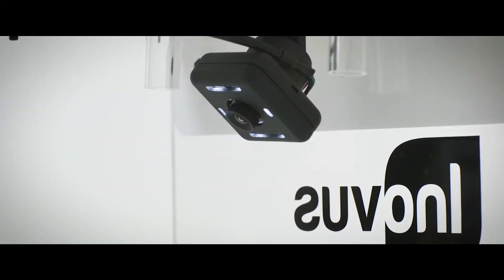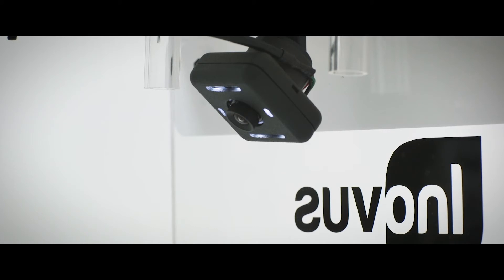The simulator has a fixed camera internally, and this has its own light source built in, so it gives you that feel that you would have in theatre of a direct light source onto the area you're looking to operate on.